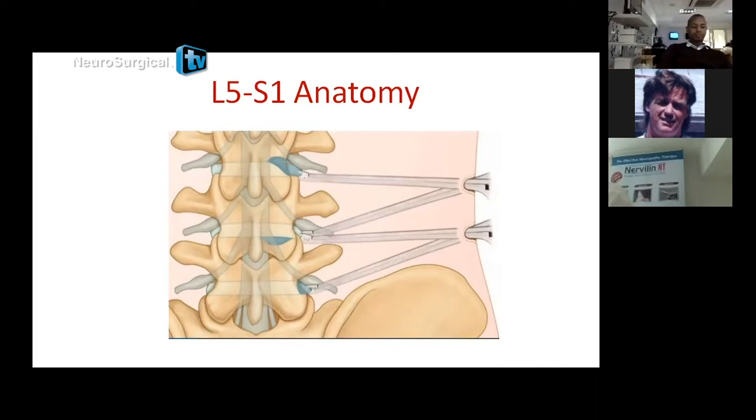I don't accept it, actually, because if you cannot enter from here, it doesn't mean that entering as if you are doing L4-5 will let you find your way. Never do transforaminal then. Go interlaminar, microdiscectomy. Because entering this doesn't mean that you are going to take the fragment out. You have to place your working cannula in the exact place. I think it's very important.